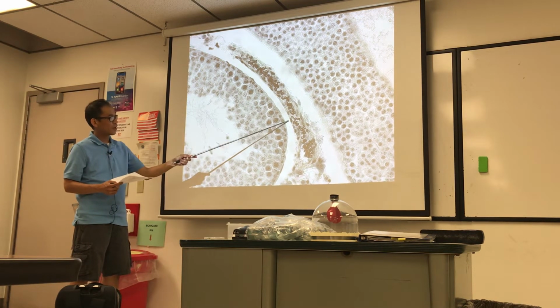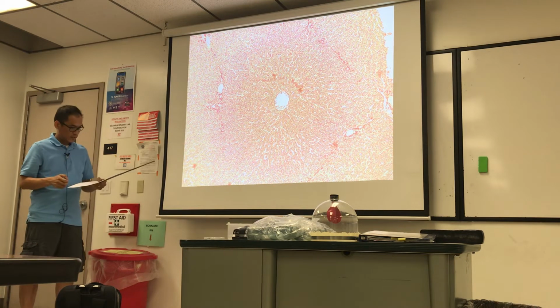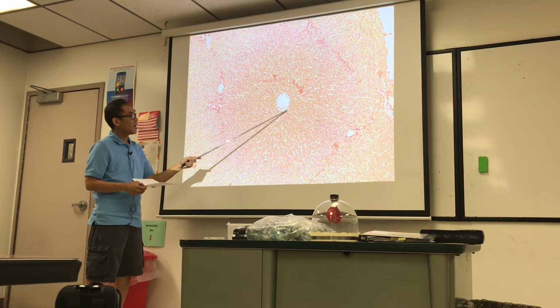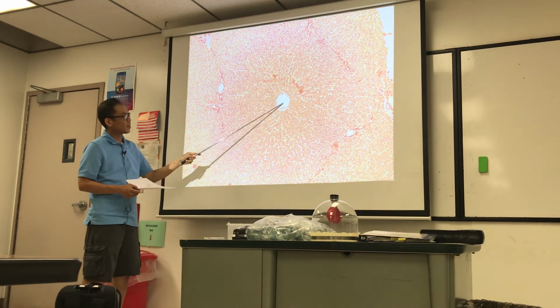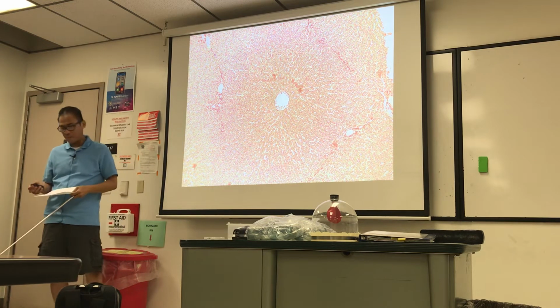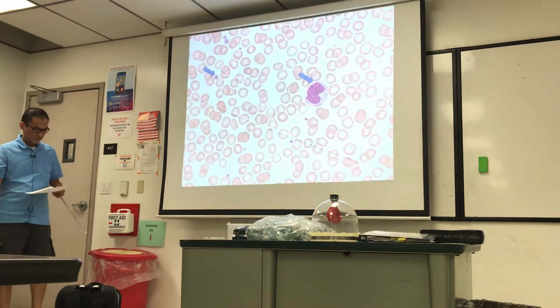Just call it capillary. How many layers? One. Just a TI. This is a venule. Right there. There's TI, TM, no TA. Anyways, this is at the center of a liver lobule, but that's the structure, that's the lumen, that's the vessel wall of the venule. So that is venule. It happens to be from liver. So we're going to get into other slides here, but this is a closer up view of the venule.